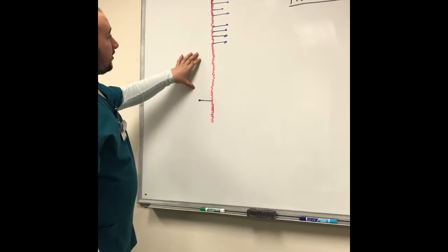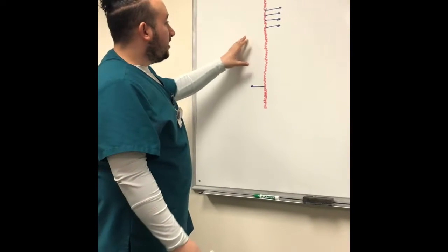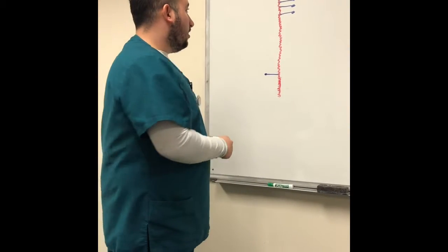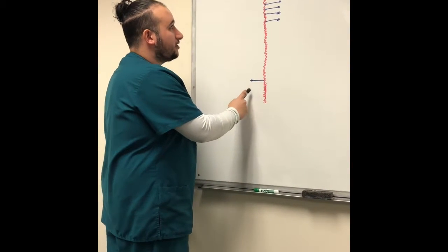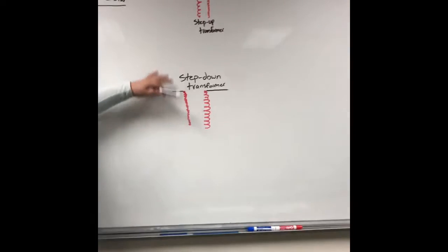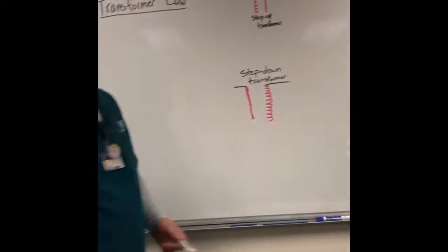The thing about the auto transformer is that the transformer is in series instead of parallel. So the coils are actually stacked onto one core, or they are stacked on top of one another. The auto transformer, like I already said, has the kVp selectors and the line voltage compensator. So really the transformer law comes into place when we talk about step-up and step-down transformers, because it has to do with the number of turns in a primary or secondary coil.